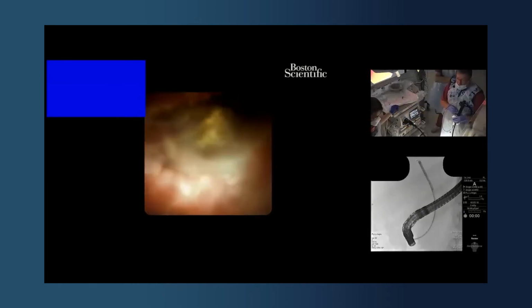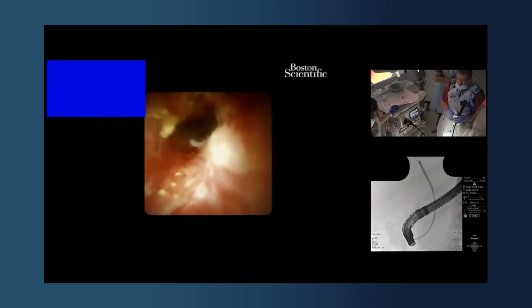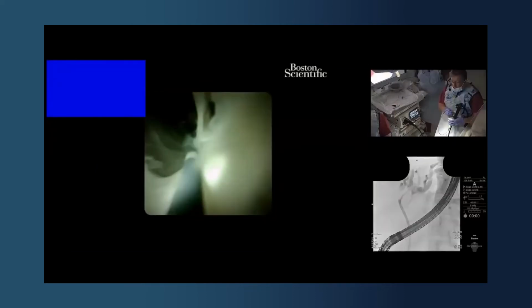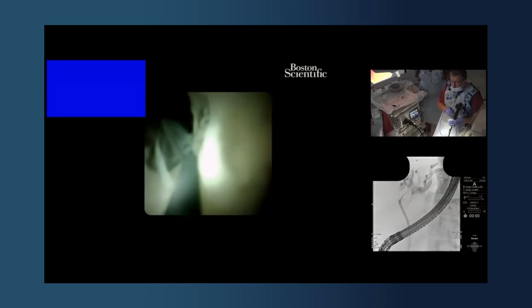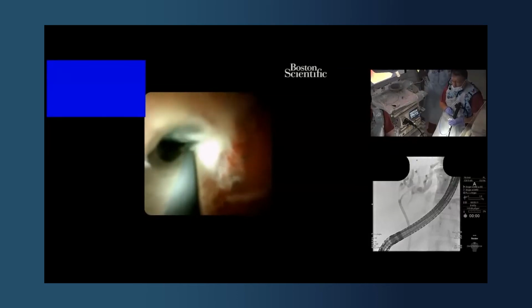Now, I'm not too worried about these small little residual stones. What I really need to do is to see if there's any way of getting into the left duct system. Just wander up here. Right, well that is very, very interesting. I think I may be in the left duct system now. And you can see at 4 o'clock the abnormal mucosa extending into the right anterior ducts, just here, even to the extent I would say that the origin of the left is sort of uninvolved.